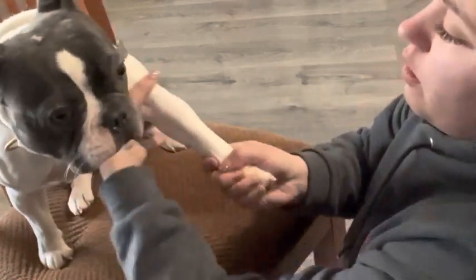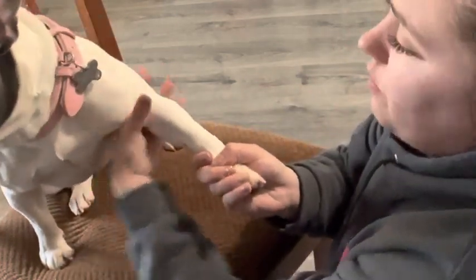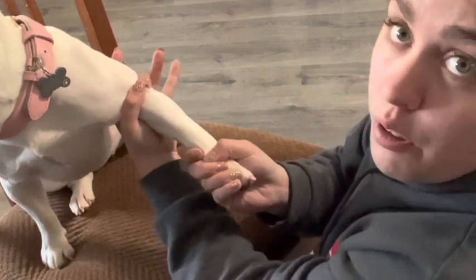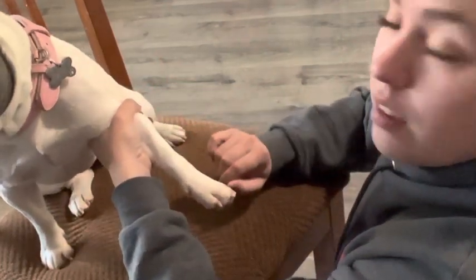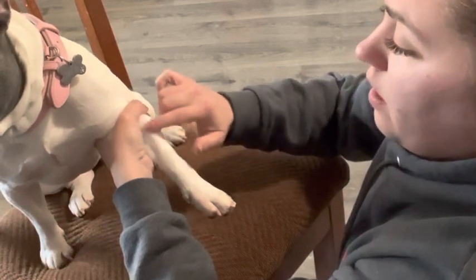So basically what you're going to do, you're going to stretch the dog's leg out like this. Grab with your two fingers and twist. Now right here, you can see it right here. That's the vein.